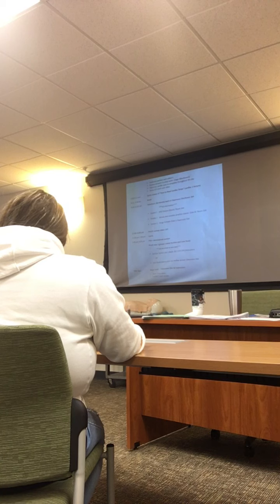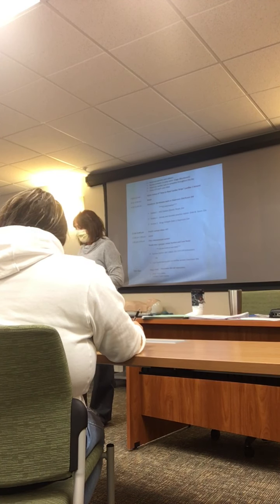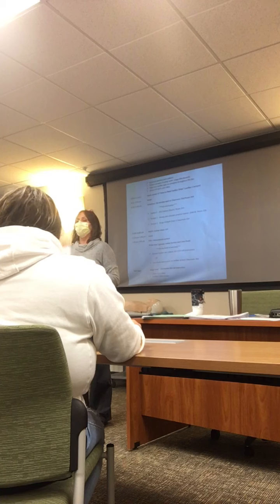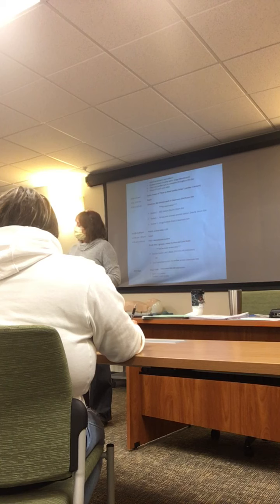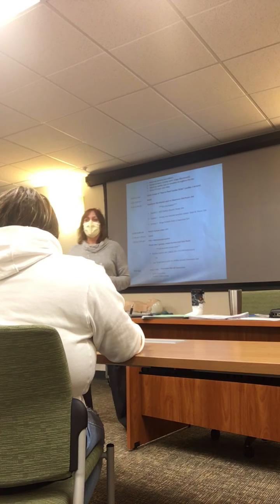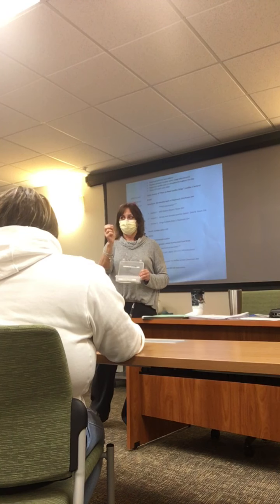Permanent pacemakers are here. I showed you these on Zoom, but you can actually look at them. They're little tiny devices that are usually implanted in the subclavian area. Also, implantable cardiac defibrillators are the same thing. They're just a little bit bigger, and some of them are even smaller now. This one does not have leads. It actually just goes in the patient's skin. The implantable cardiac defibrillators or the pacemakers, they will go in a patient's chest, and they have leads that plug in here that we actually insert into the heart muscle.